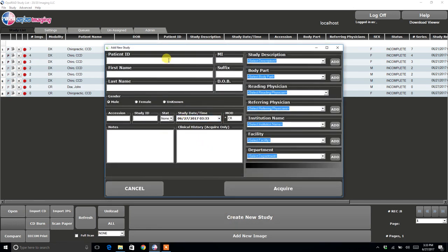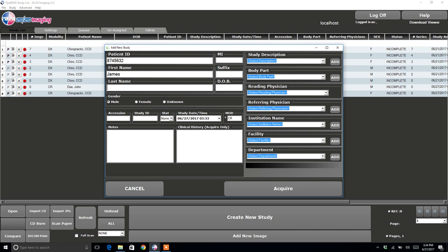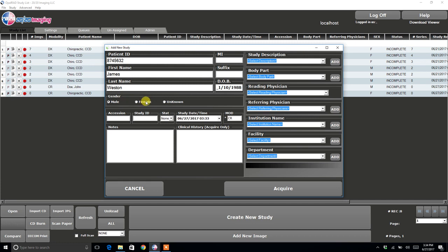From there you will enter in the patient's demographics. Enter in their name, date of birth. Then you select the gender: male, female, or unknown.